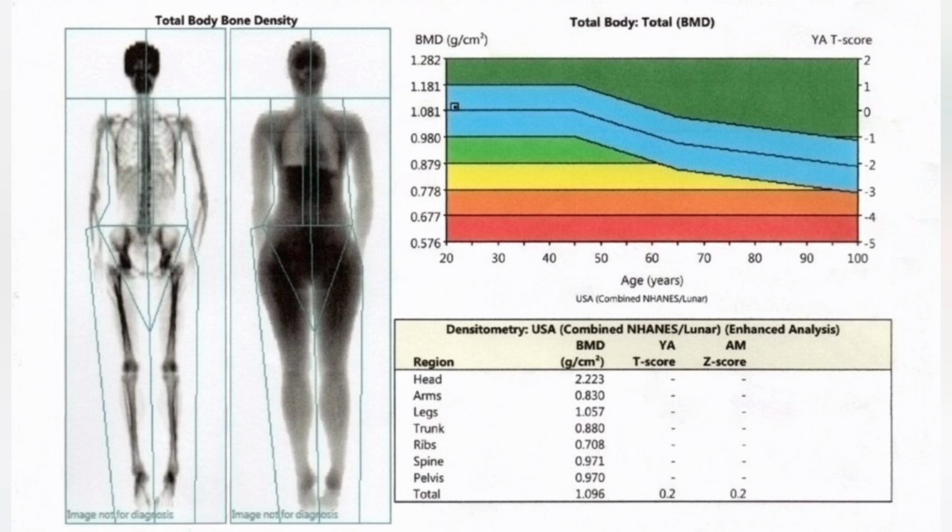them to measure BMD. Then you compare it to the patient with peak BMD, that is sex and race matched: T-score, useful to calculate osteoporosis risk. In individuals of the same sex, age and race matched: Z-score, better for looking at metabolic bone diseases. Use calculating osteoporosis risk in individuals who have fragility fractures.